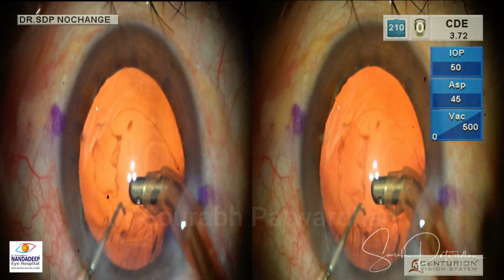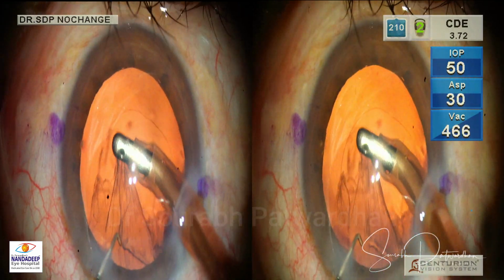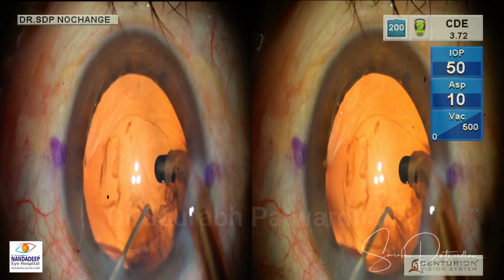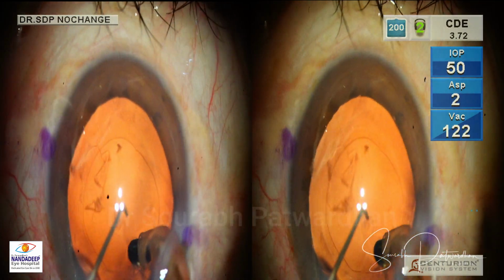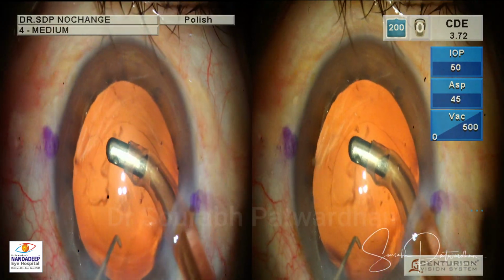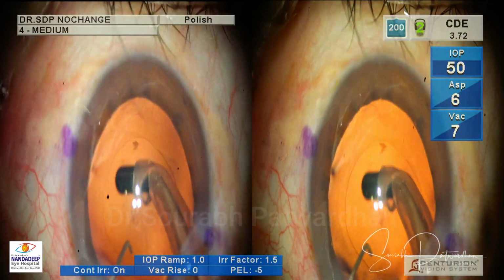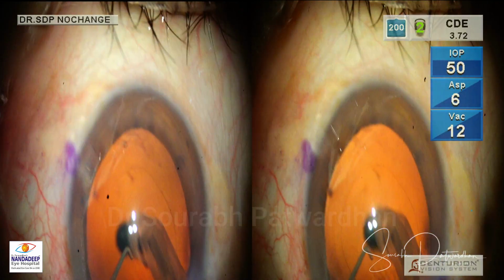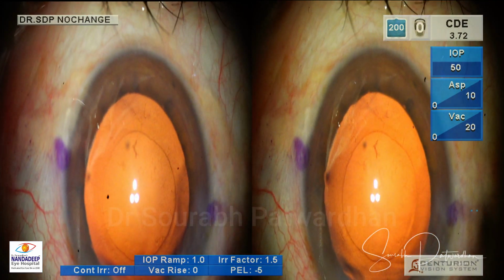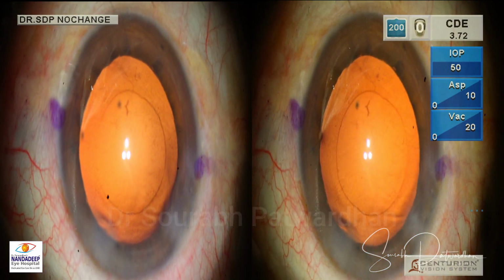Yeah, so you don't have to even move it around if you're pulling it posteriorly, because it's the fluid which cleaves. I think Dr. Vasavda sir has shown this technique with bimanual. It's called POPs or something. POPs only, yeah. So what is done is that you pull the cortex back, so fluid kind of goes in and cleaves the cortex away.